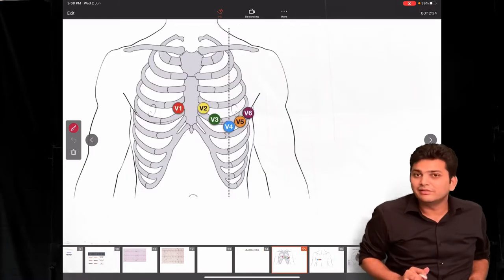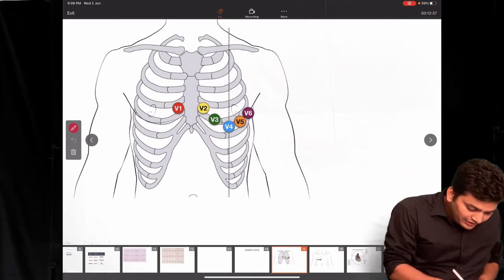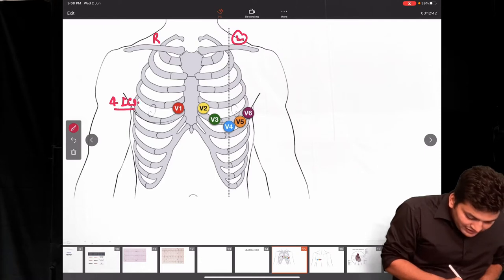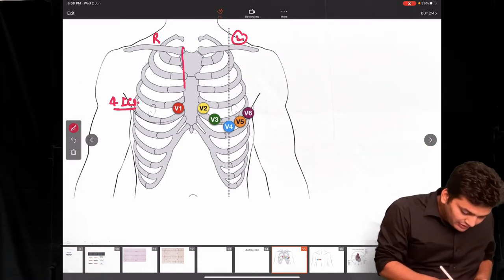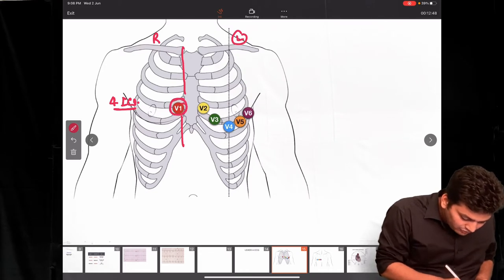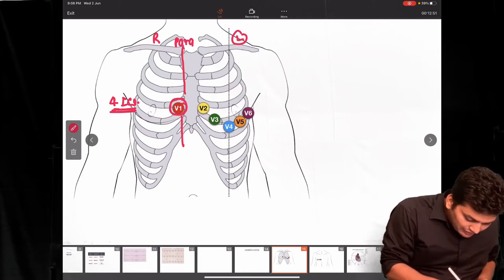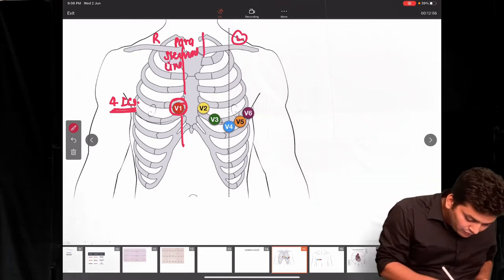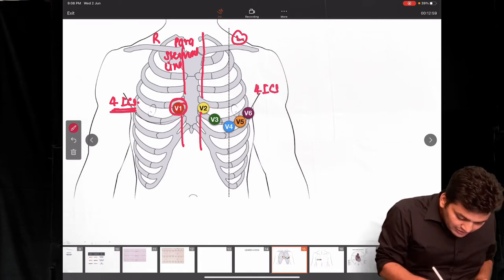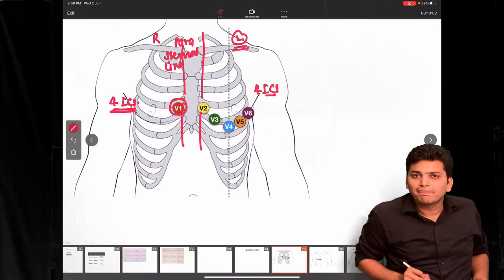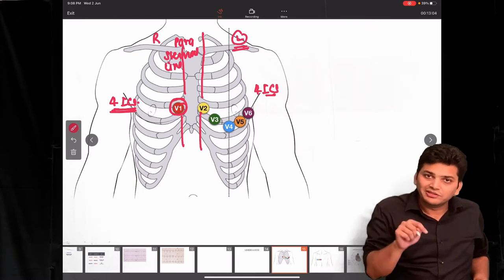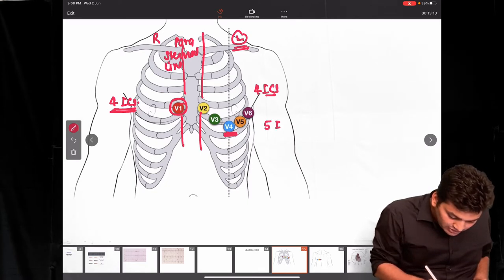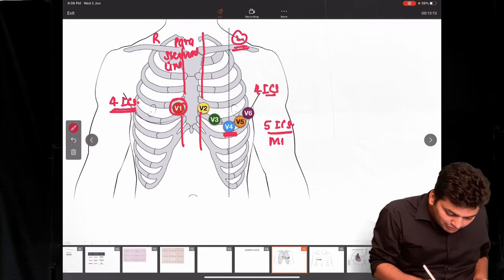For chest lead placement, we start from the fourth intercostal space on the right side in the parasternal line — this is where V1 is placed. Then V2 is placed in the same fourth intercostal space but on the left parasternal line. Next, we place V4 first — not V3 — in the fifth intercostal space at the mid-clavicular line.